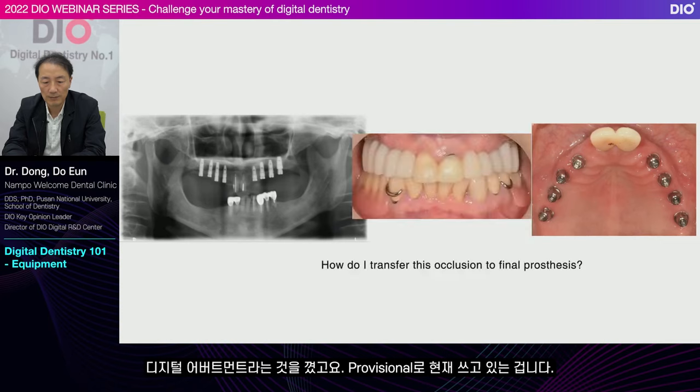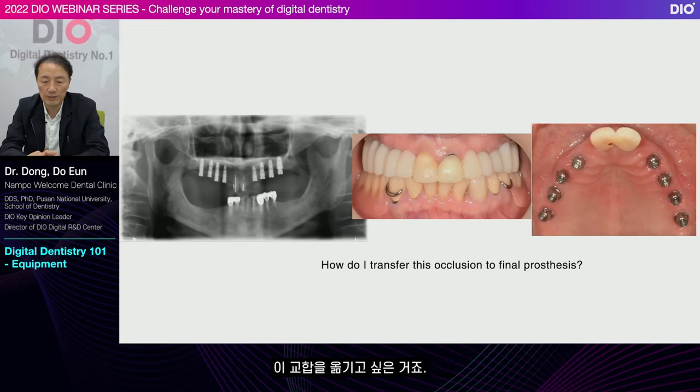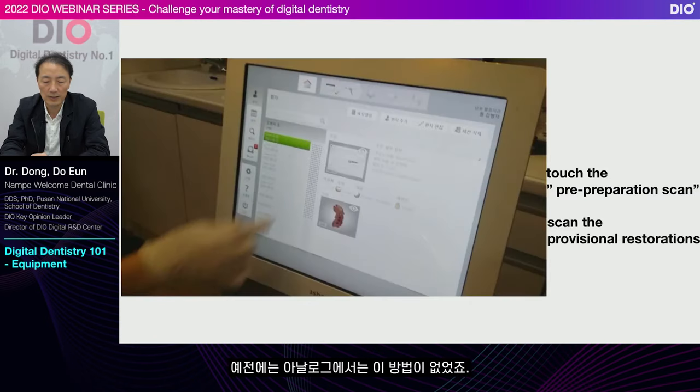It has a digital abutment. This is used as a provisional currently. This provisional prosthetic is used for 2 to 3 weeks, or at most 2 months. I want to transfer this occlusion to the final prosthesis. There was no way to do this in the analog method.